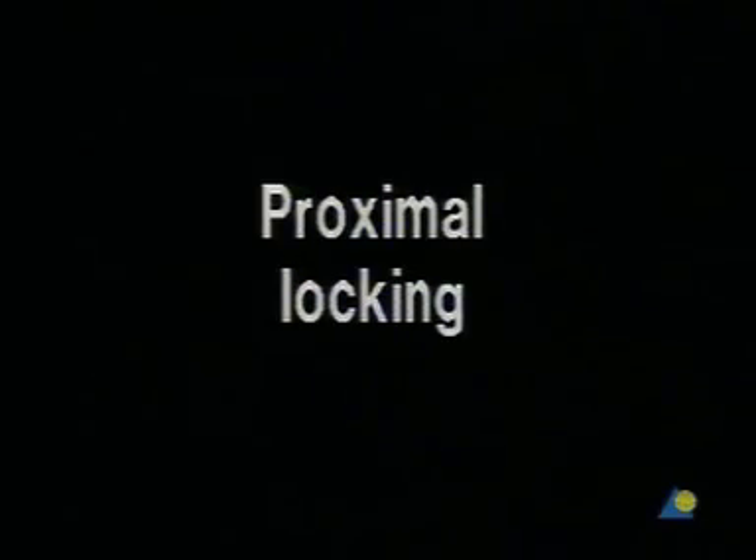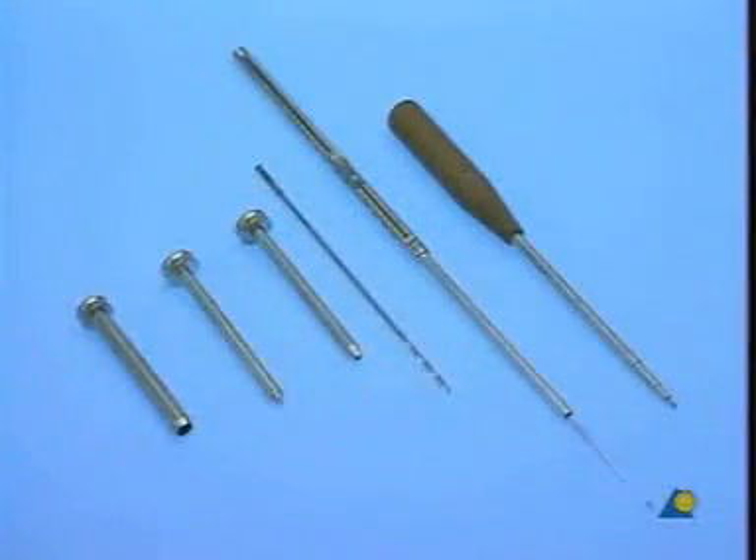Proximal locking. The following instruments are needed for proximal locking: a protection sleeve, a trocar, a drill sleeve, a 3.2 millimeter drill bit, a depth gauge, and a screwdriver.